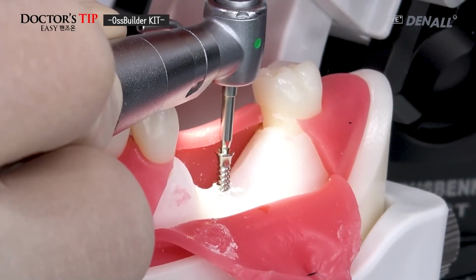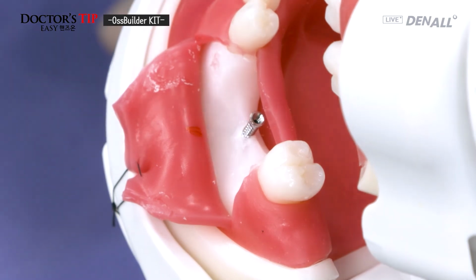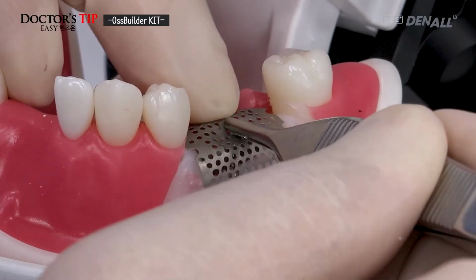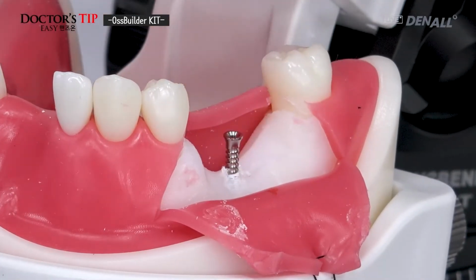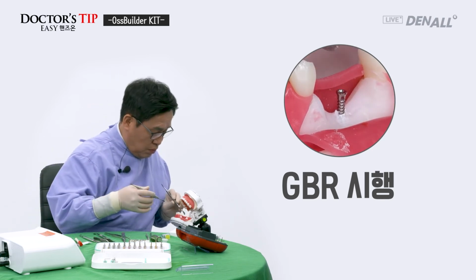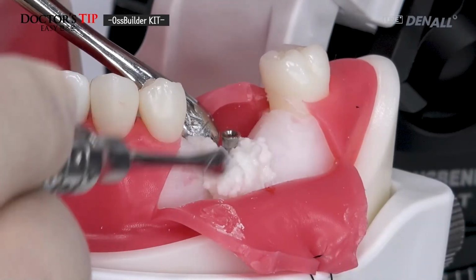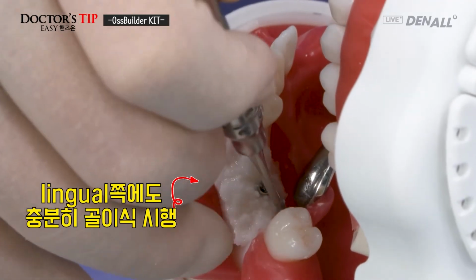I am drilling 5mm. As you can see, the tenting screw has been placed in the desired position. The OssBuilder that I chose earlier, I'm going to apply once again like this. As you can see over here, I'm going to do bone graft. I'm going to put sufficient amount on top. On lingual side, place sufficient amount of bone graft.